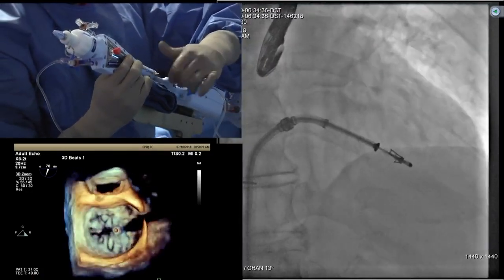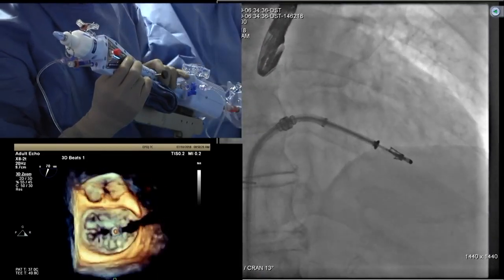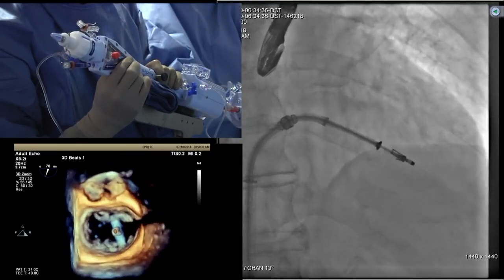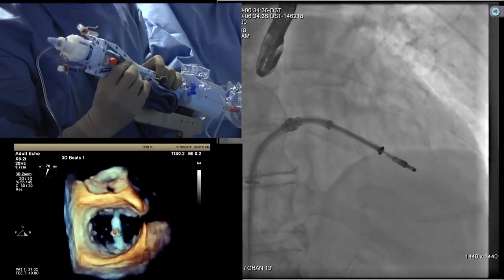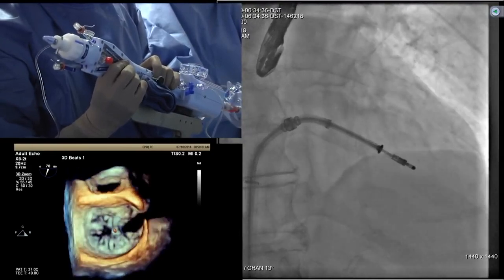Okay, so I'm going to release the knob again. And little movements. Every movement has to be small and gentle movements. Translate like that, like flossing, dental flossing. See that? Good. That's better. Nice. Okay. Enough. Yeah, good.